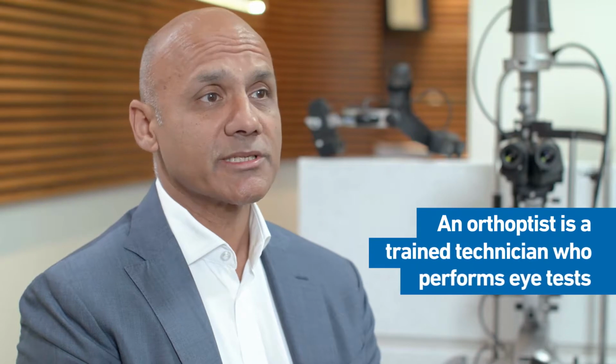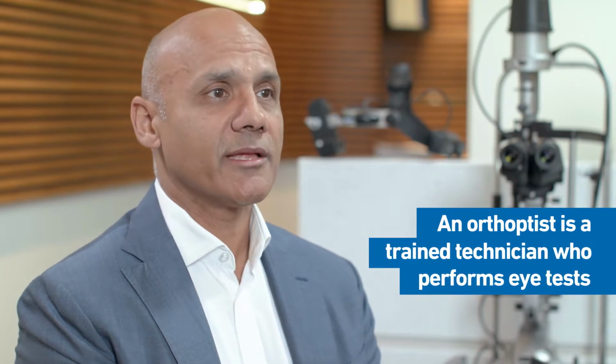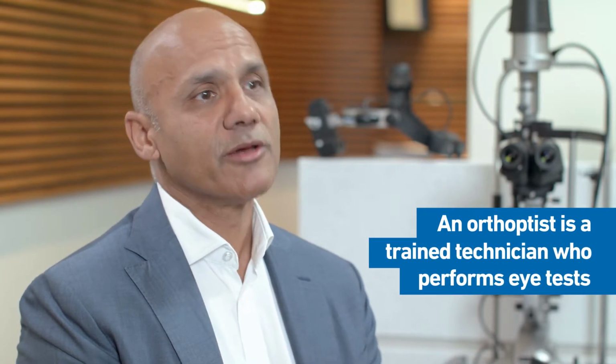You'll meet the receptionist first, who will simply ask you to take a seat in order to wait for the orthoptist to see you. The orthoptist is a technician who's been trained specifically in doing eye tests and actually knows a lot about retinal problems as well. The orthoptist will measure your vision, test your eye with a scanner called an OCT scanner.